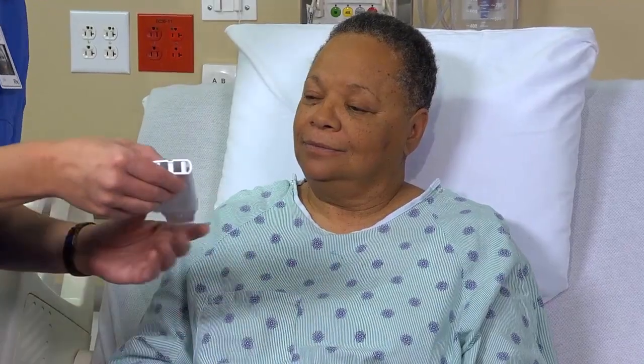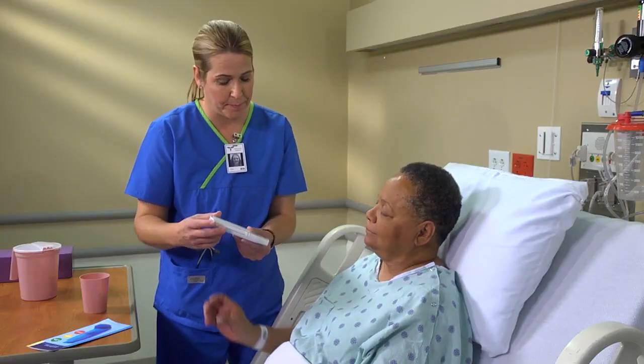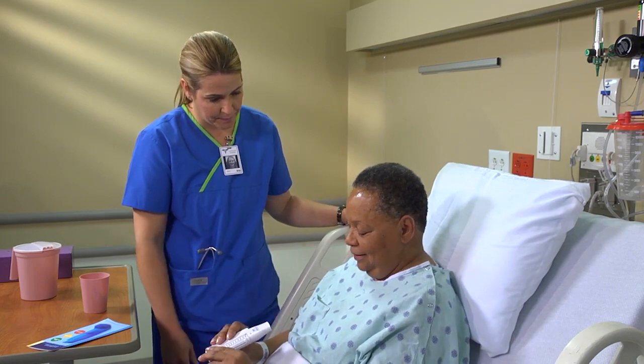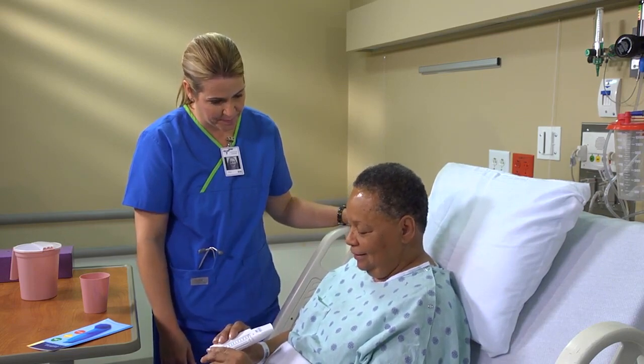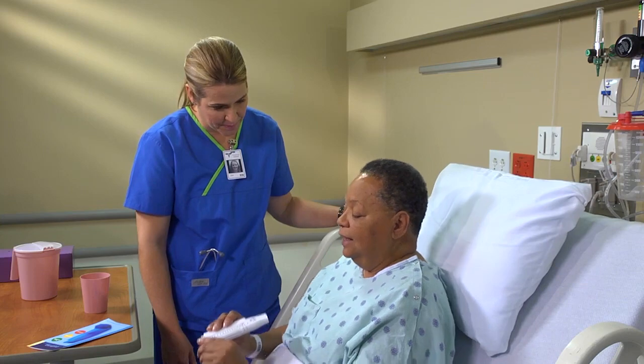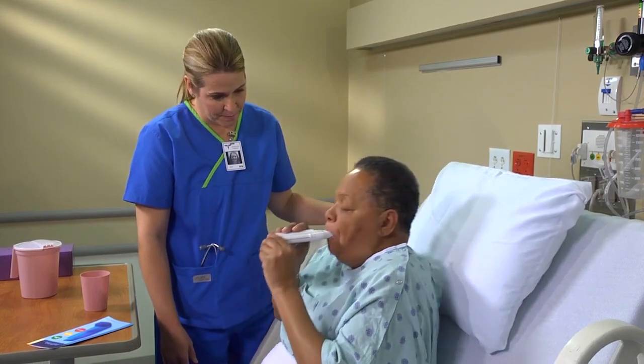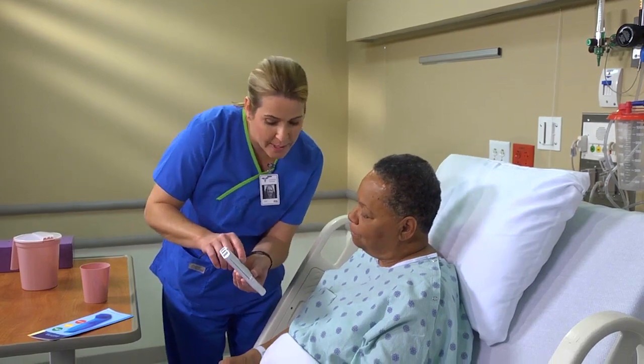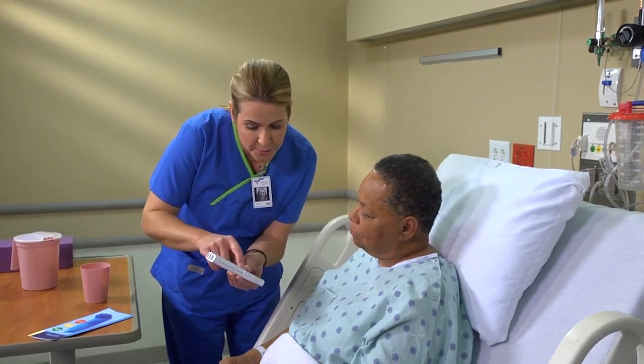All right. One more time. Repeat this maneuver twice more and record the highest reading in the chart or in the patient's diary. If the patient is to record PEFR at home, have her demonstrate this technique independently and assess her ability to record her readings accurately on a chart using a traffic light pattern.